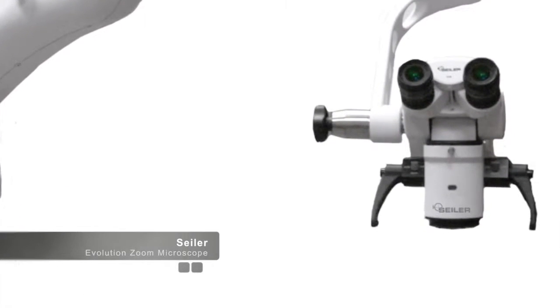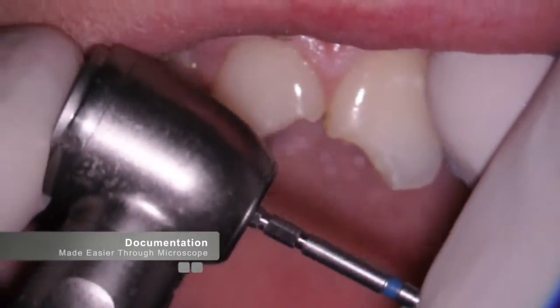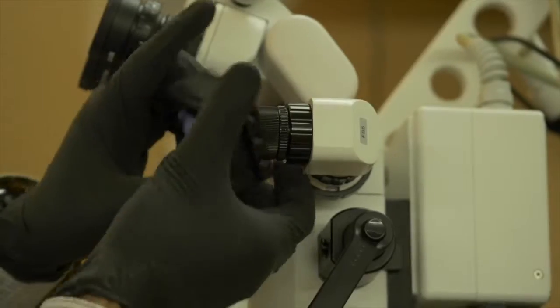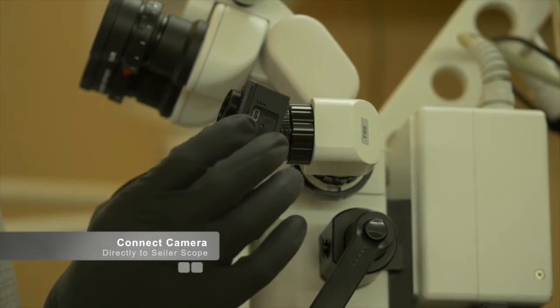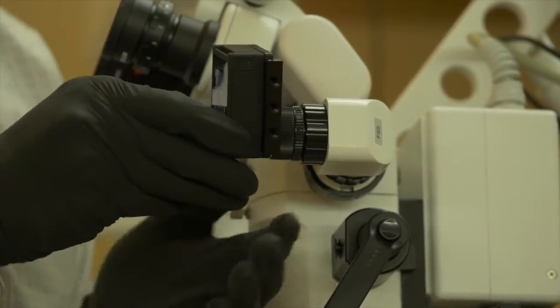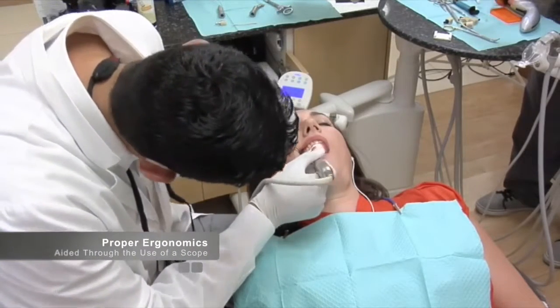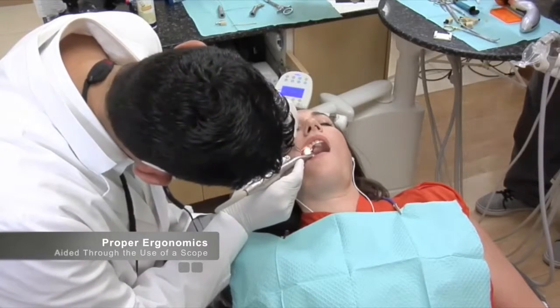Another reason that I've personally used a microscope for years is that it simplifies my ability to document cases for educational purposes. This is critical for someone who is presenting cases regularly. Having the case documented through a scope in either video or still format is an invaluable tool for both doctor and patient education, as well as to contain any potential medical legal situations that invariably may arise in the clinical setting. With the importance of magnification and documentation discussed, one more benefit of using a microscope is ergonomics.